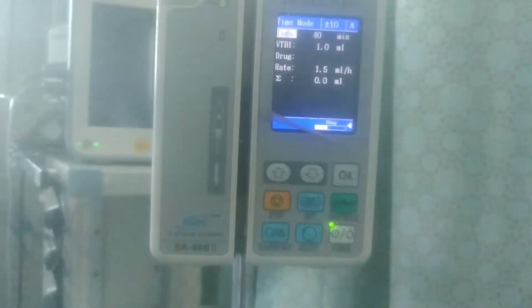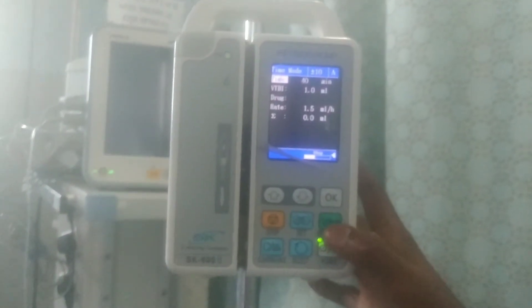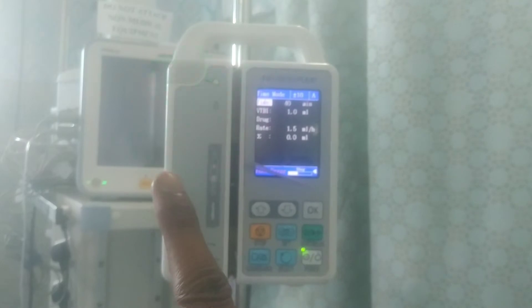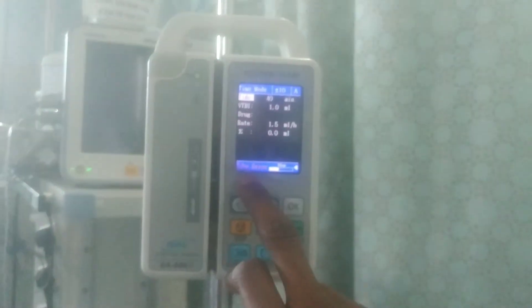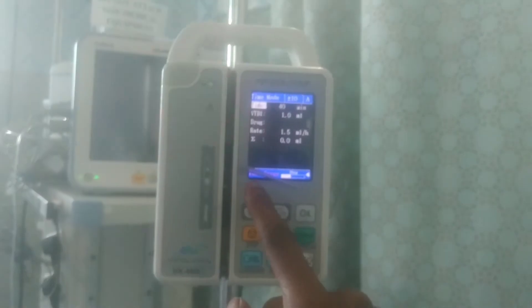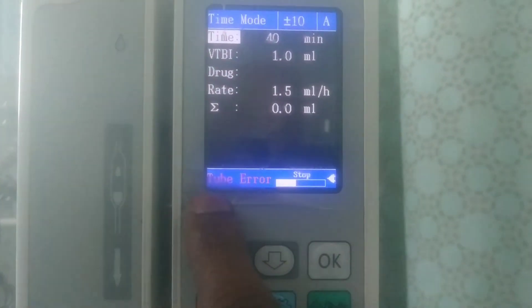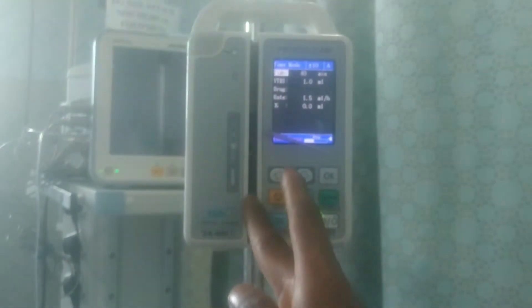When you are done with all the settings and want to start the infusion, click the start button. The infusion is supposed to start. If there is no drip set loaded, an alarm will sound and a 'tube error' message will appear on screen. This alarm and light signify that there is no tube — the tube error means there is no drip set passed through the channel.